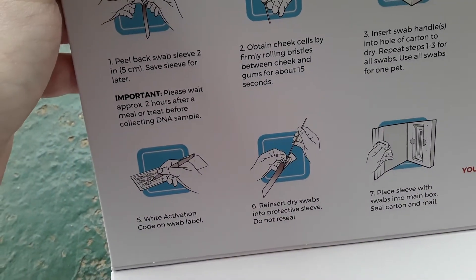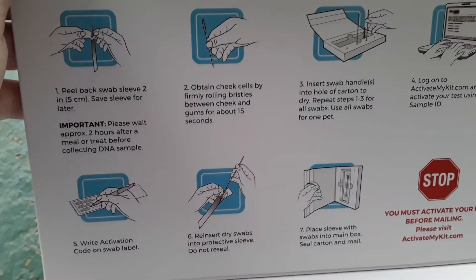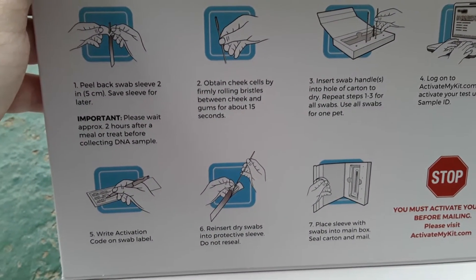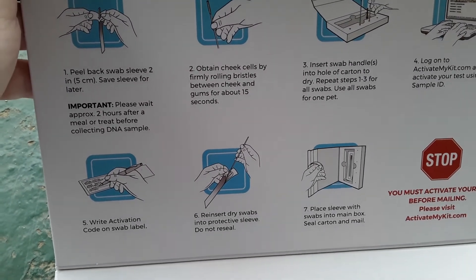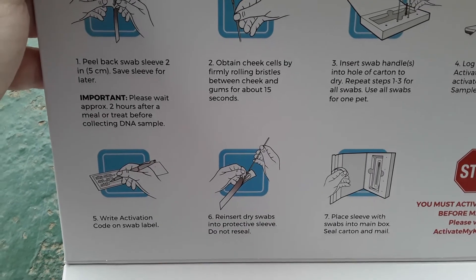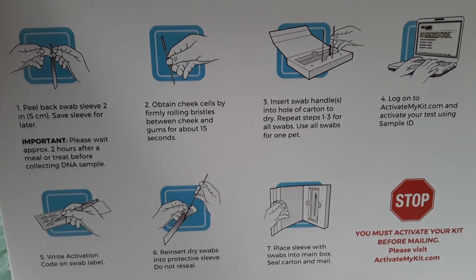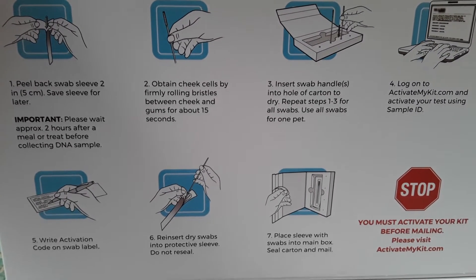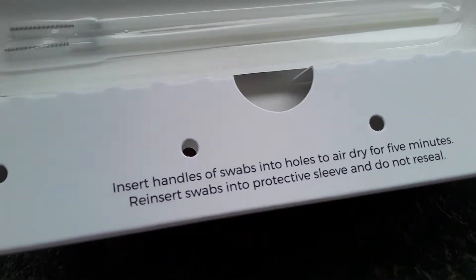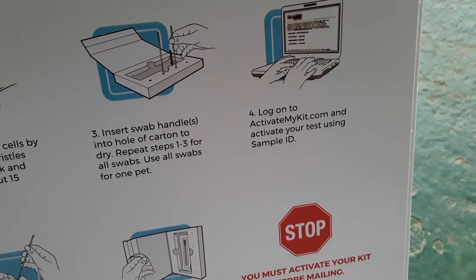Basically, you have two swabs right here. You're going to peel it back and save the sleeve — don't throw away the sleeve. It tells you to please wait about two hours after a meal or treat before collecting a DNA sample, so it's best to do this in the morning after they've slept. Then you're going to take the cheek cells by rolling the bristles between the cheek and the gums. Right here you have little holes so that you can air dry the swabs.